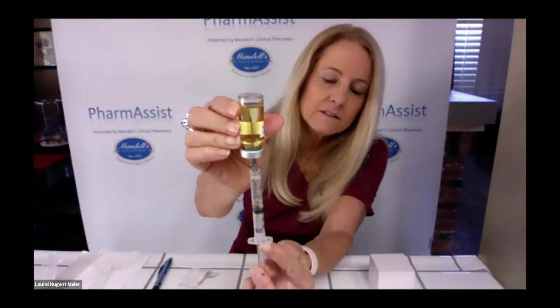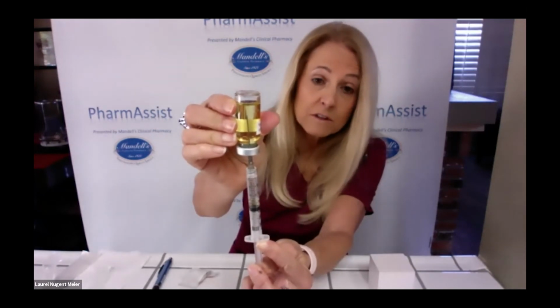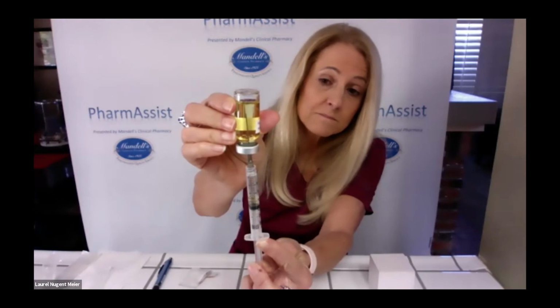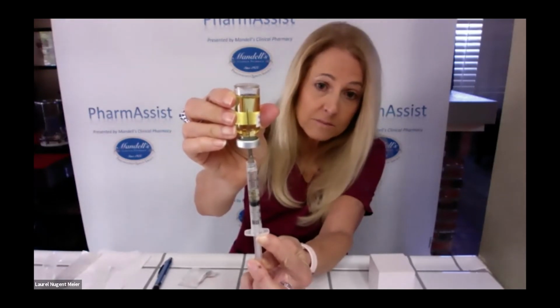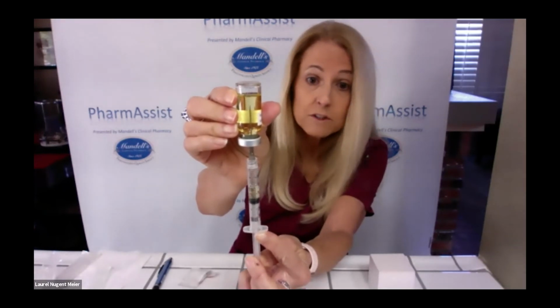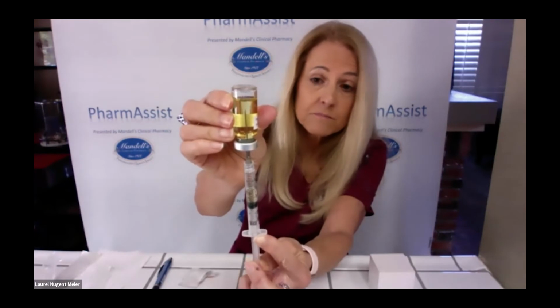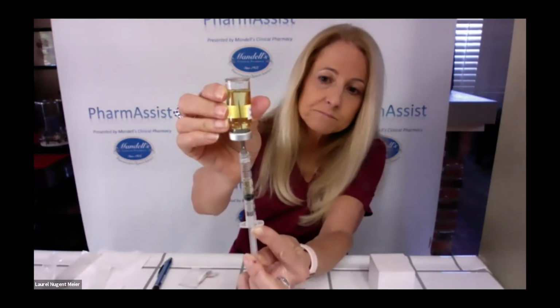And the thinner the needle, the longer it takes to draw it up. So if they give you a large bore needle, you can go ahead and use that because it'll make it a lot faster to draw it up. But whatever they give you that's already attached to the syringe is the one you're going to be drawing it up with. So keep going until you're a little past the 1 line.